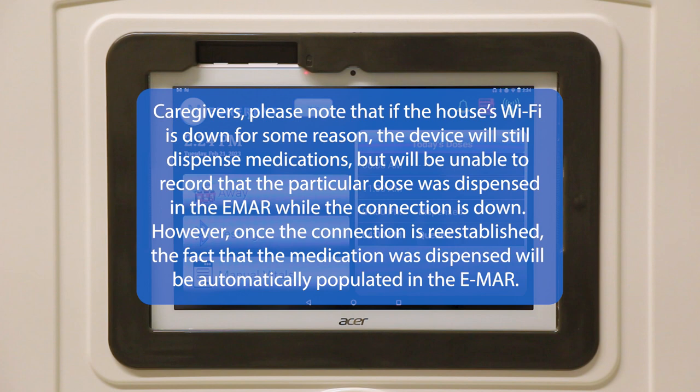Caregivers, please note that if the house's Wi-Fi is down for some reason, the device will still dispense medications but will be unable to record that the particular dose was dispensed in the EMAR while the connection is down. However, once the connection is re-established, the fact that the medication was dispensed will be automatically populated in the EMAR.